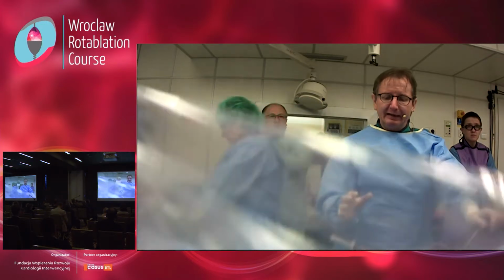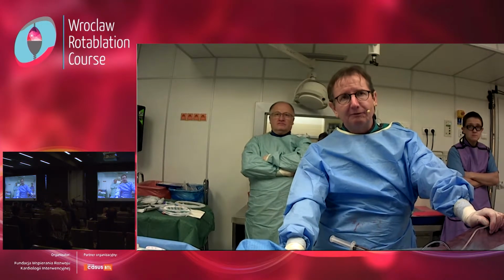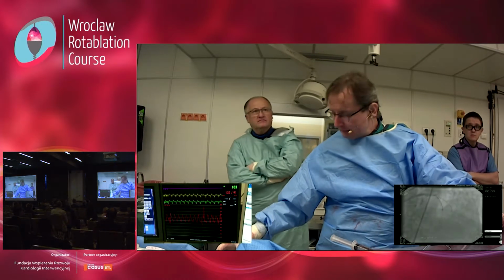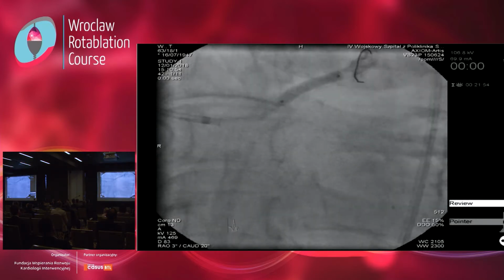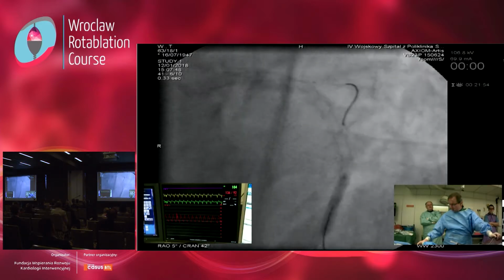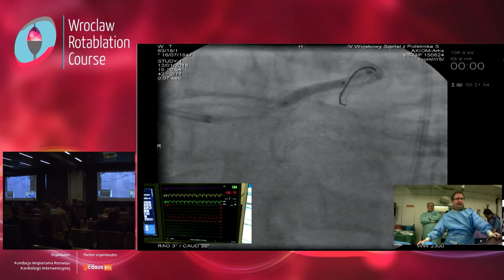What we have done in this acute situation, we put very fast a stent from the left main. We can maybe go back. So it was post-dilatation. After this post-dilatation, we put 4.0 post-dilatation proximal.